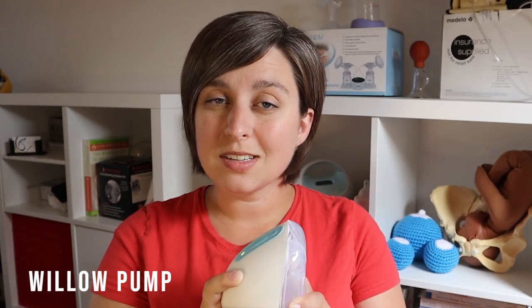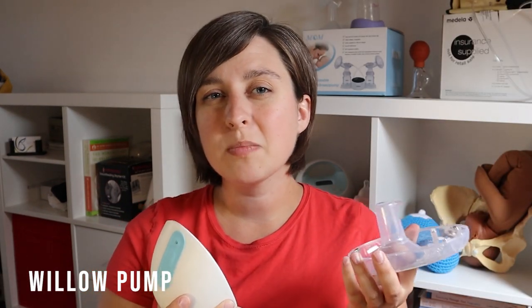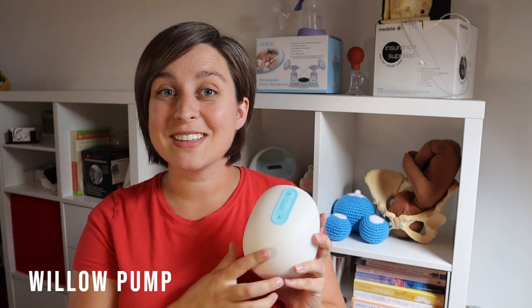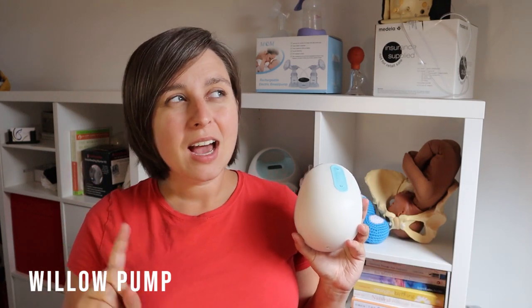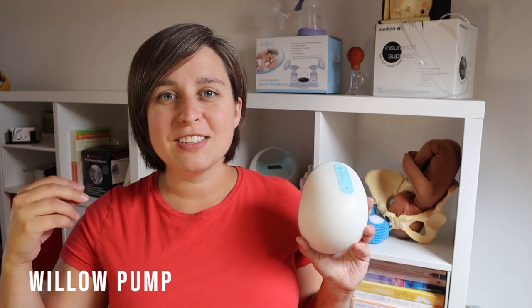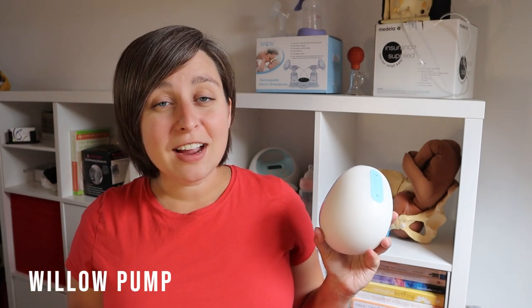The Willow is also pretty easy to clean — just a couple of extra parts. The pump part itself doesn't need cleaning between feedings, just the part that's touching the milk. Another really cool feature is you can connect it to the Willow app, so you can see how much milk you're pumping while you're pumping it. Anytime you add technology you add some potential for things to get fumbled, so you can take that as a pro or a con — I actually think it's pretty cool.